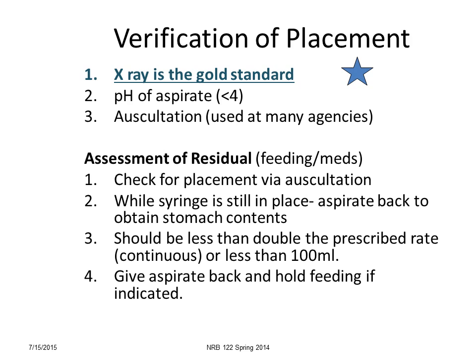We also need to check for residual if the patient's getting continuous or intermittent feedings. And by that we mean how much is left in the stomach before we give them more. And typically if they're on a continuous feeding and we check the residual and we get 100 mils, we don't want to give the feeding. We want to hold it for a while. And we're going to explain that more when you see it in class.